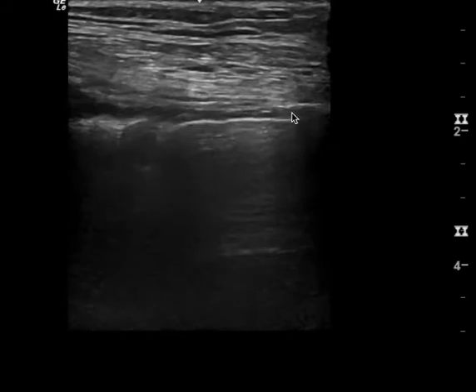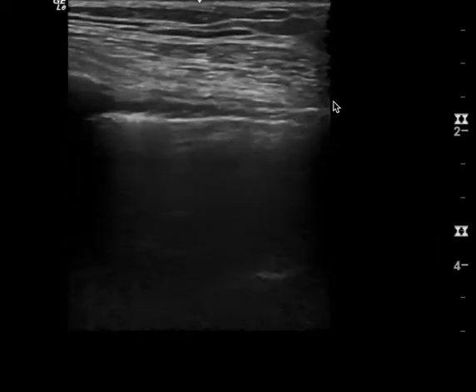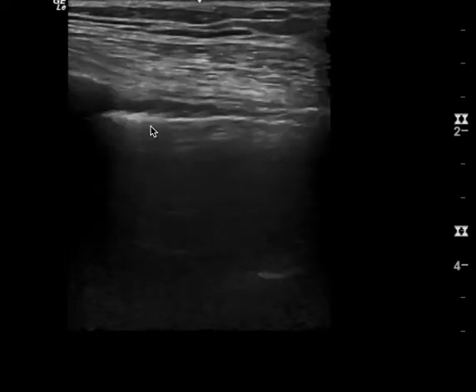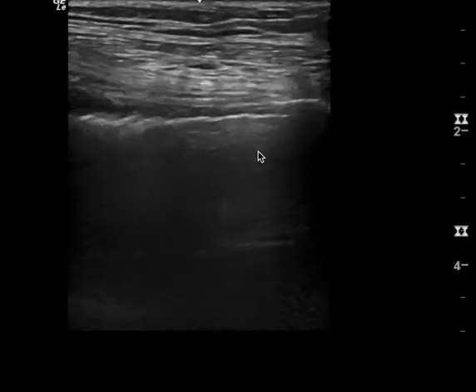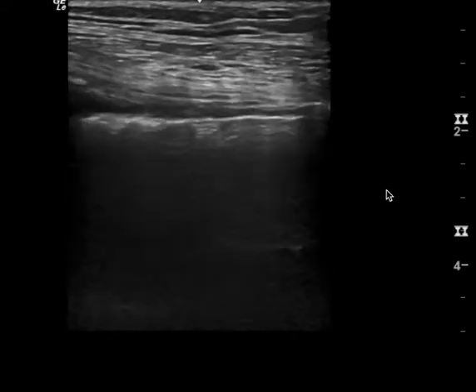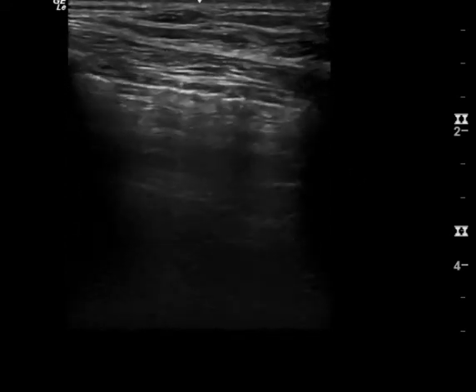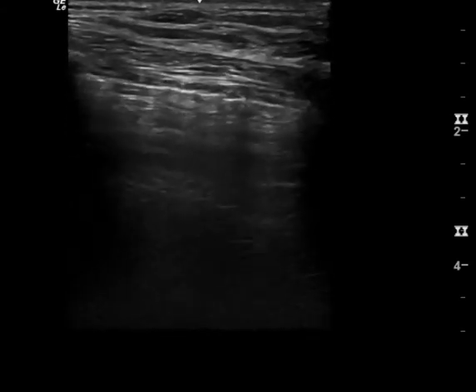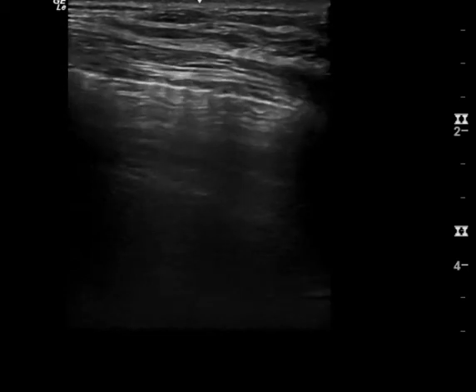This is another view here. To me, not as obvious, but rib, and you can see the lung sliding right here. No lung movement at this part of the thorax, but then you do see movement here, and you put this clip here compared with this clip, and this is a classic lung point that's just concerning for an ultrasound pneumothorax.